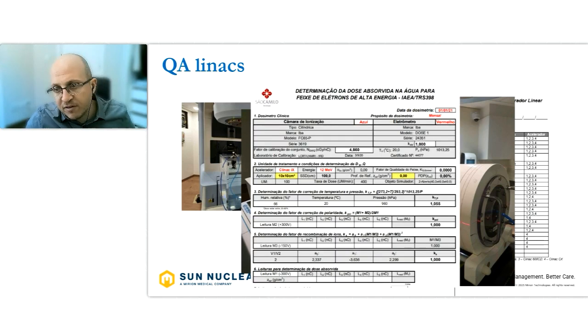But I would like to emphasize another component, the last but not least: the physicists need to choose a data recording and analysis system. And these are traditionally made by spreadsheets and paper forms.